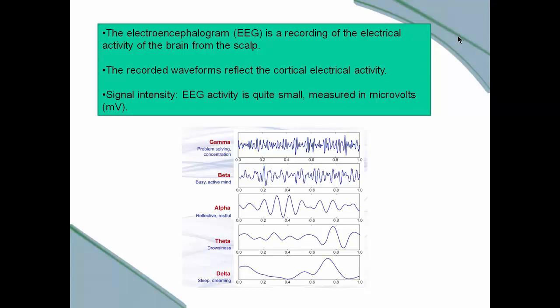But that, as you'll remember, was on a large sheet of paper. All those brain waves we saw going back and forth were pins going back and forth on this piece of paper, and the paper was rolling along. We don't do that anymore. Now we simply record the signals much more accurately and make those signals available for analysis of almost any kind digitally. But this is what it looks like.